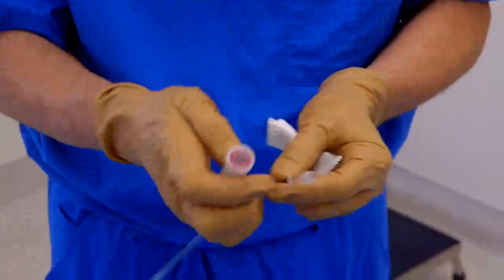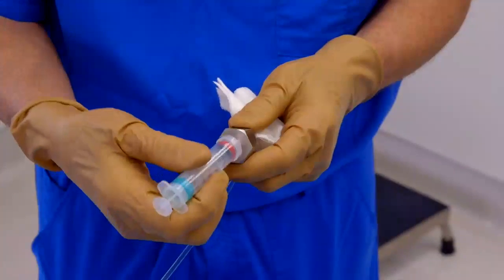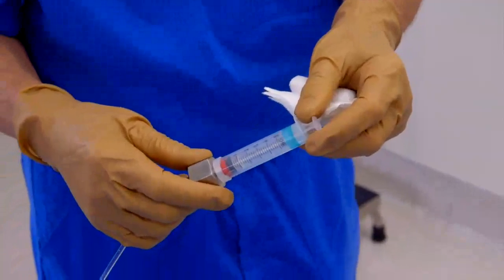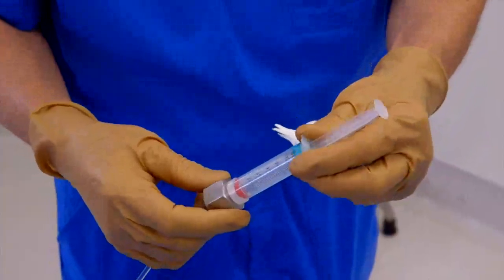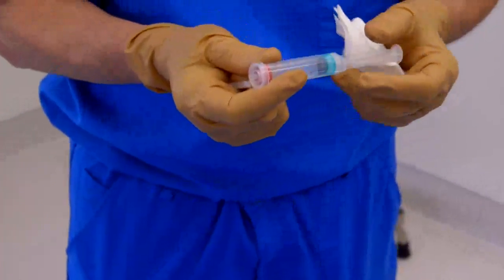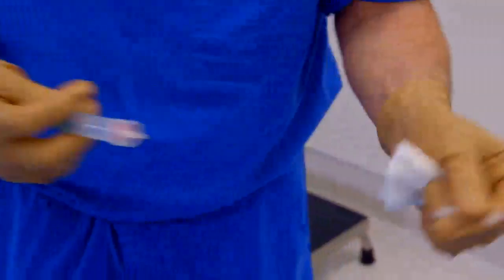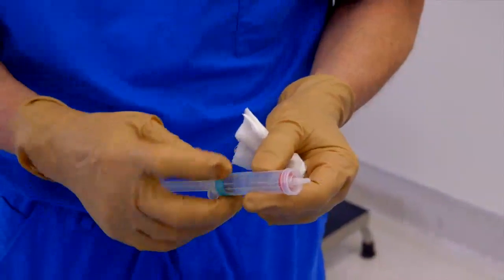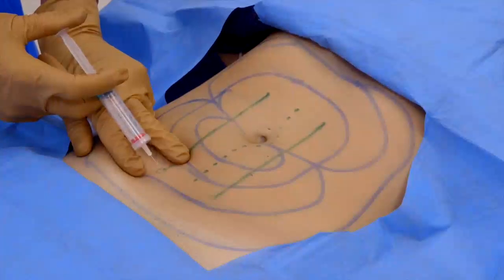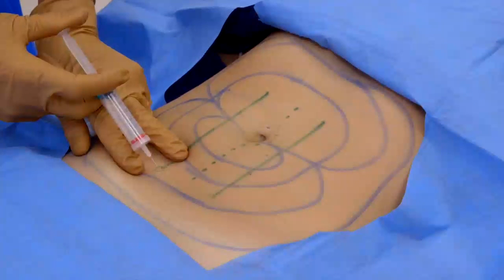We apply an empty syringe to the stainless steel hex connector, and then using the peristaltic infiltration pump, we simply load the syringe with the solution. Then, using a 30-gauge safety needle applied to the syringe, we're ready to inject blebs of tumescent local anesthesia into the dermis. I will inject approximately one cc into the dermis at the site where the sub-Q cath will be inserted.